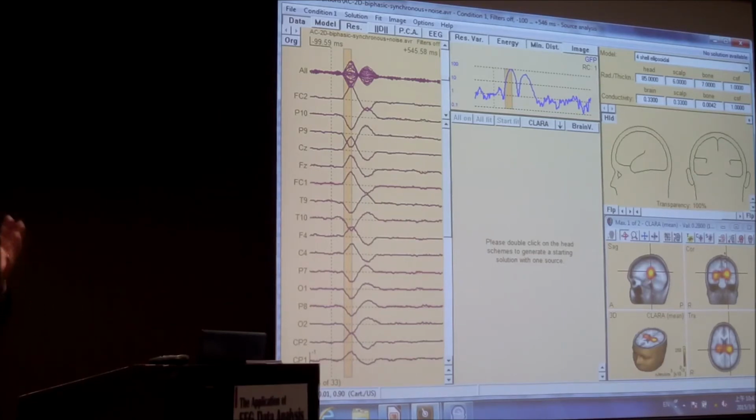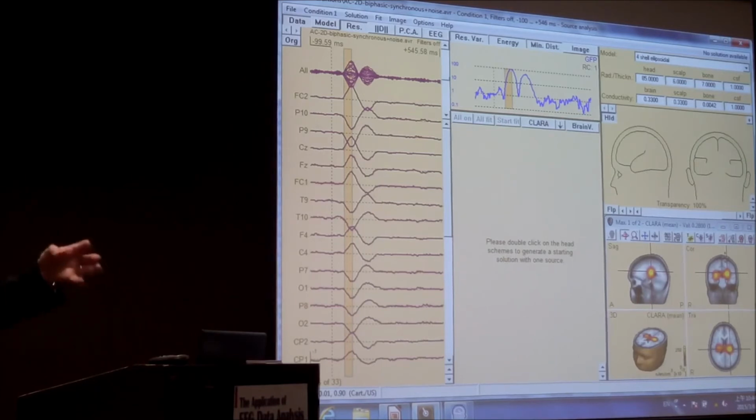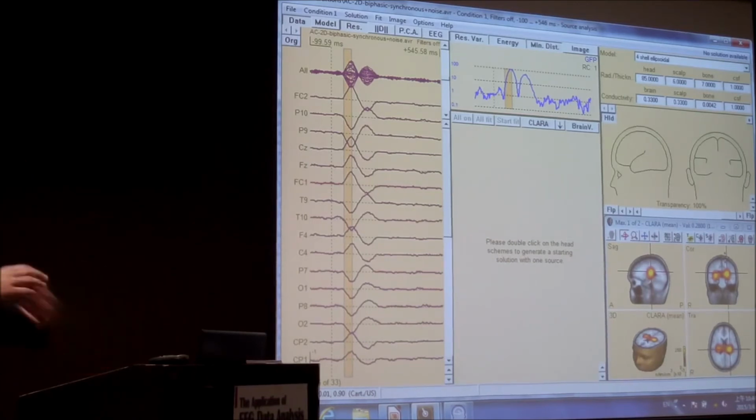I can recommend to go through the literature and look at what the people did, whether the results look promising or not, and which method they used. Try to apply the same conditions to your experiment, and then see whether this method is working for you as well. But that's really difficult to say, almost impossible, because if I change some modalities within an experiment, even Loretta, which is made for that kind of experiment, may fail. So that's the difficult thing. It's impossible to say.